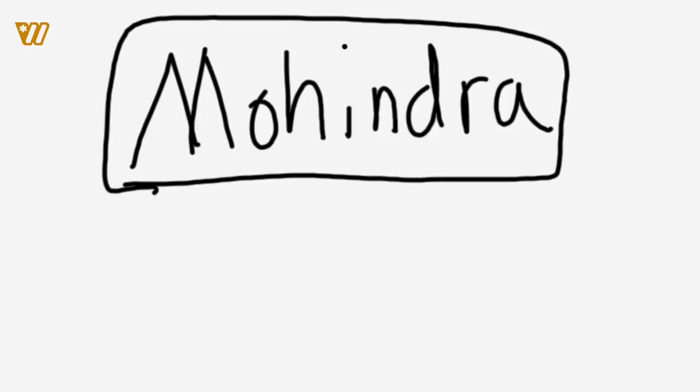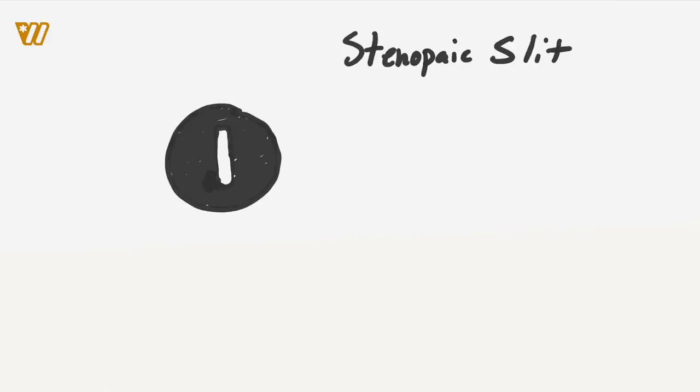All right, guys, let's keep on going and talk about the stenopeic slit. Now we're moving into subjective refraction techniques, and the first one we want to talk about is the stenopeic slit. You guys look at it and go, Ryan, I don't remember what the stenopeic slit looks like, right? Well, here's what it looks like.